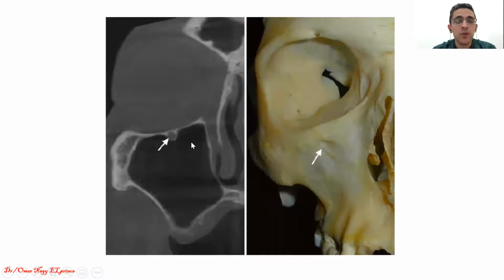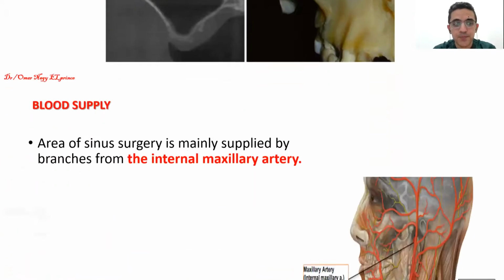اوكي so if you are trying لو انت بتشتغل في الماكسيلاري ساينس سواء بتحاول to retrieve something of the maxillary sinus or even you are trying just to make maxillary sinus lift، لازم تبقى عارف ان انت حدودك لغايه هنا. ما تحاولش ان انت تعدي اللاين اللي بعد اللاين ده بيبقى فوق، علشان you will jeopardize الانفرا اوربيتال nerve if you are trying to use any instrument which will eventually lead to numbness or nerve injury لو انت قربت من الانفرا اوربيتال nerve.